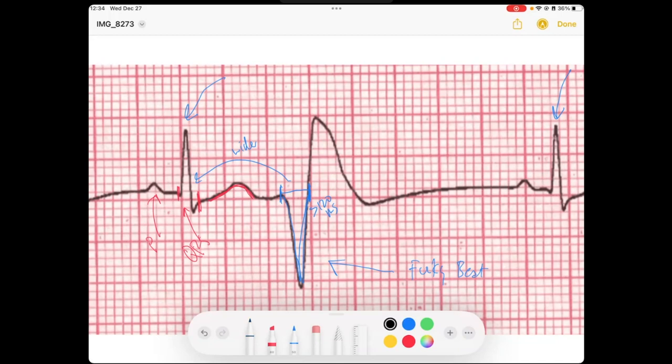You can notice that if you measure from this normal beat to the next normal beat, we would expect our next beat to occur right around here. However, this is occurring premature. And so let's evaluate that premature beat.